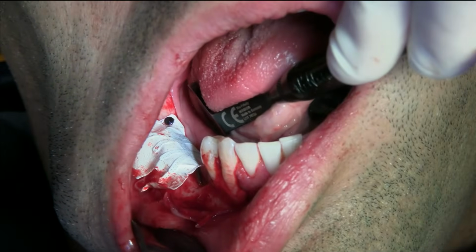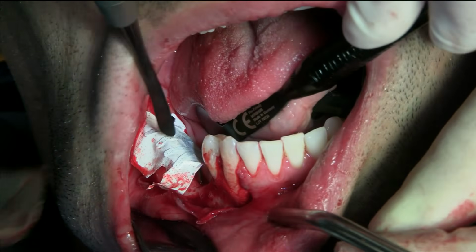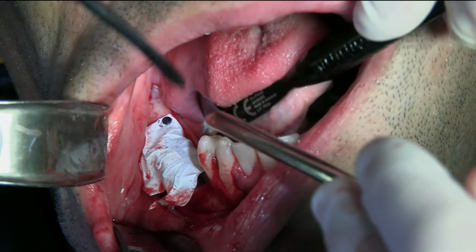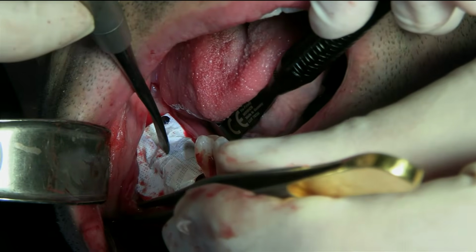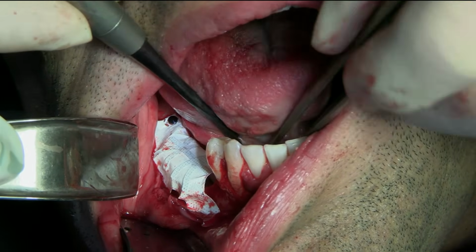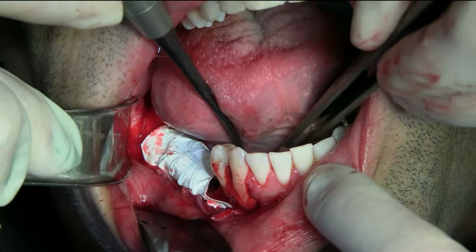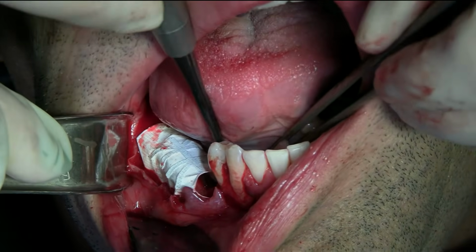You can hold it like that. Membrane will go here. Okay, now I have to get here. Yeah, you have to take your retractor away. Open as wide as you can. And where do I go? Somewhere here.